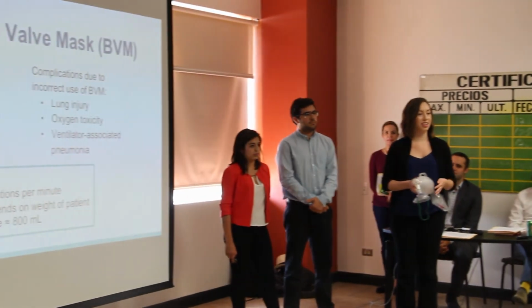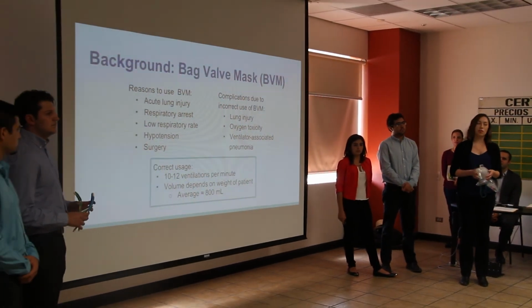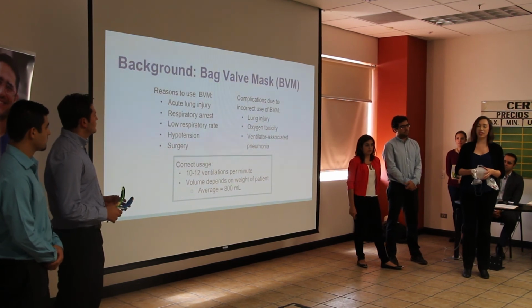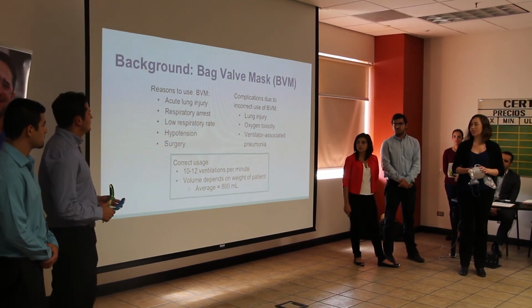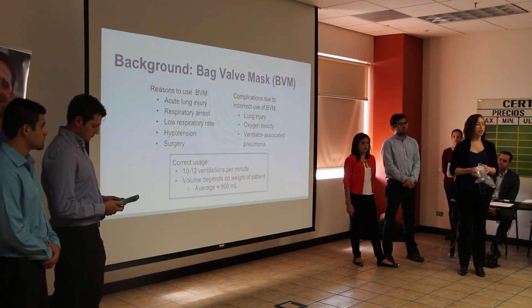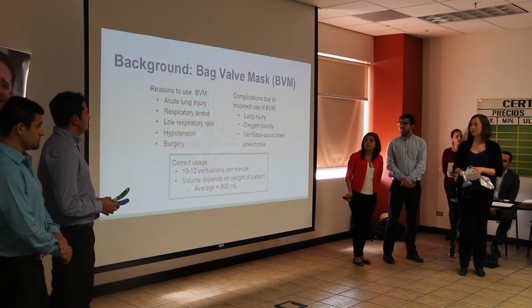Currently, the doctors usually just do this manually and don't really have a good system to tell if they're giving the right amount of air to the patients. So, if the patients are given too much air too quickly, they can have injury to the lungs, oxygen toxicity, or ventilator-associated pneumonia. So this week we were tasked with building a device that would decrease the risk of these complications occurring.